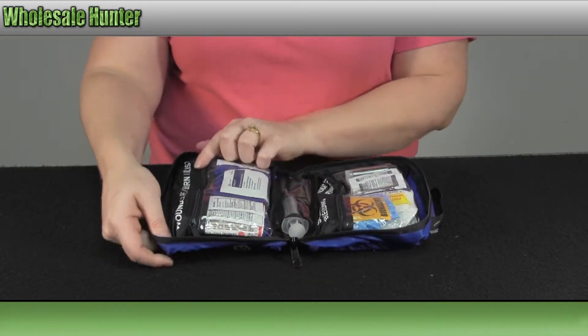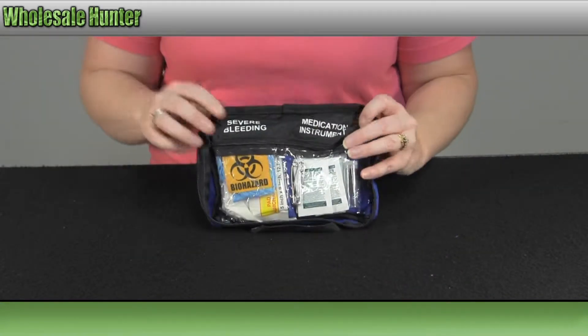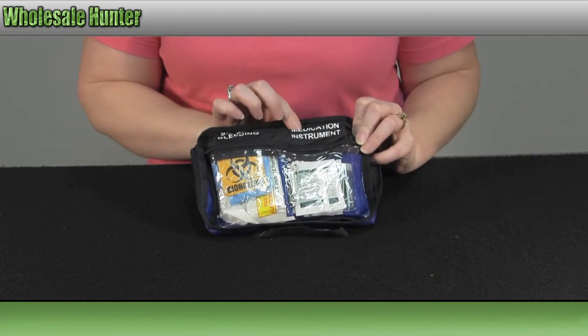Over here you have your wound care, burn and blister. And over on this side you have your severe bleeding, and your medications and instruments.